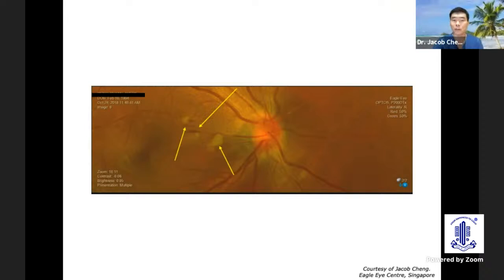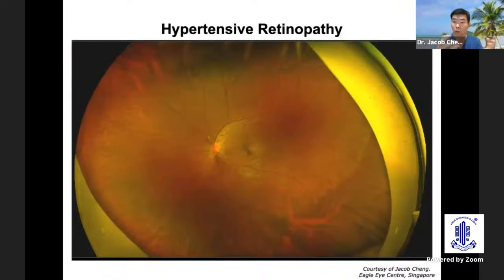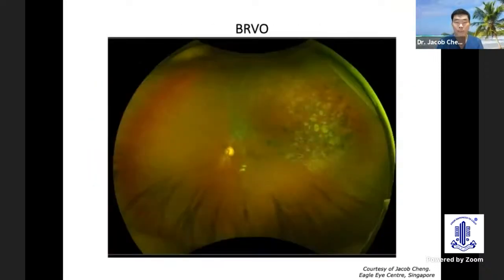In the presence of flame hemorrhages, multiple cotton wool spots, not forgetting blurred disc margin and disc swelling as well as sclerosed vessels, this patient has a hypertensive retinopathy, which can be diagnosed even on the wide field without losing the details. And of course, on the opposite eye, again, we do see the cotton wool spots as well as some sclerosed vessels. This diagnosis is obvious.